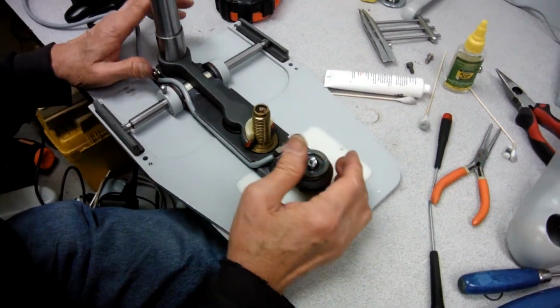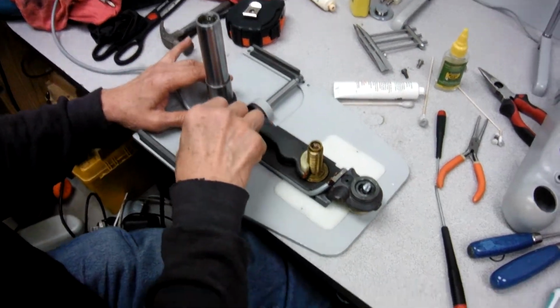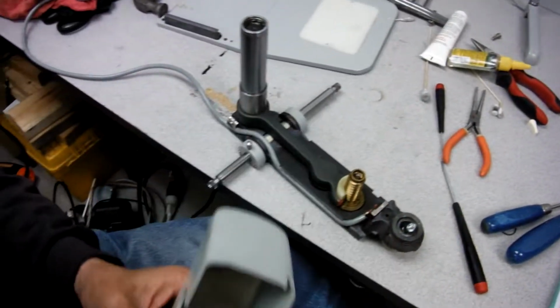Okay, that's just to check it out before you put everything back together. Okay, so now it's working. So I put it locked back in place there, and I'm going to put the top in there.